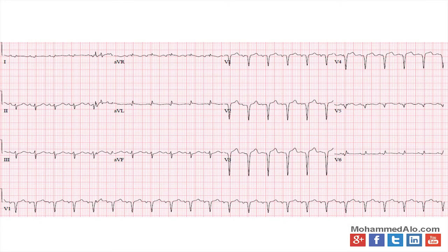Next EKG here shows you what looks a little bit on the tachycardic side. So here, if you look at this slide, you see slight elevation in V3 and V4. It's a little bit subtle, but you also see a depression in lead 3 there. So this is more of a subtle anterior elevation MI. Just be careful that you don't miss these. The computer might pick it up or might not, but that's why every EKG should be reviewed by a physician. 2, 3, and AVF, definitely the ST segments look down, especially compared to the PR line, and there is definitely V lead elevations in the anterior segments.